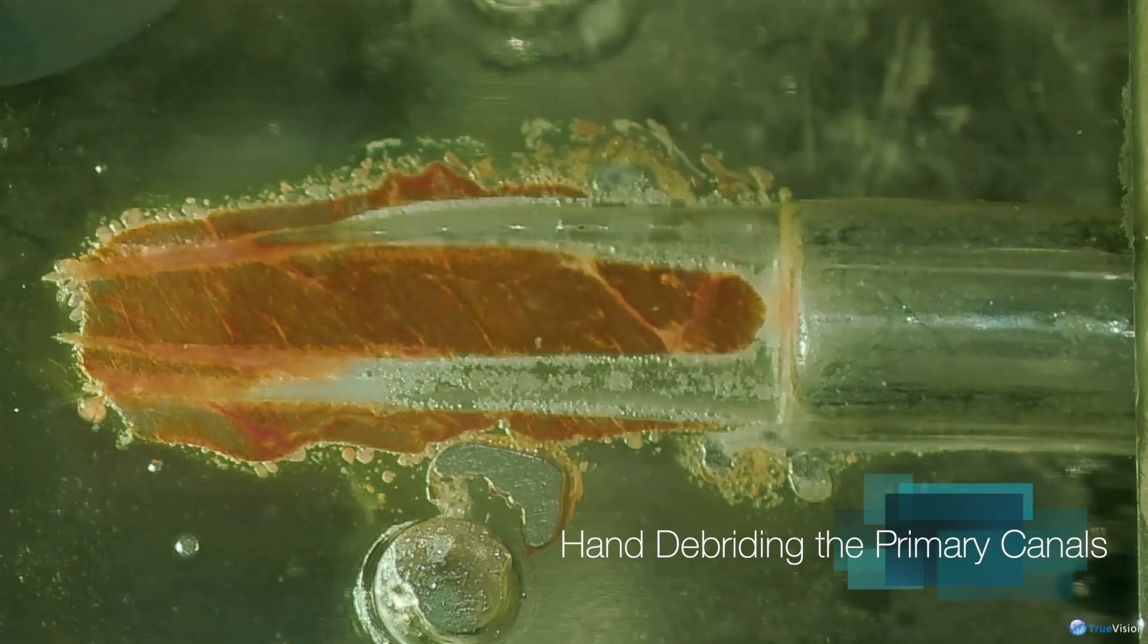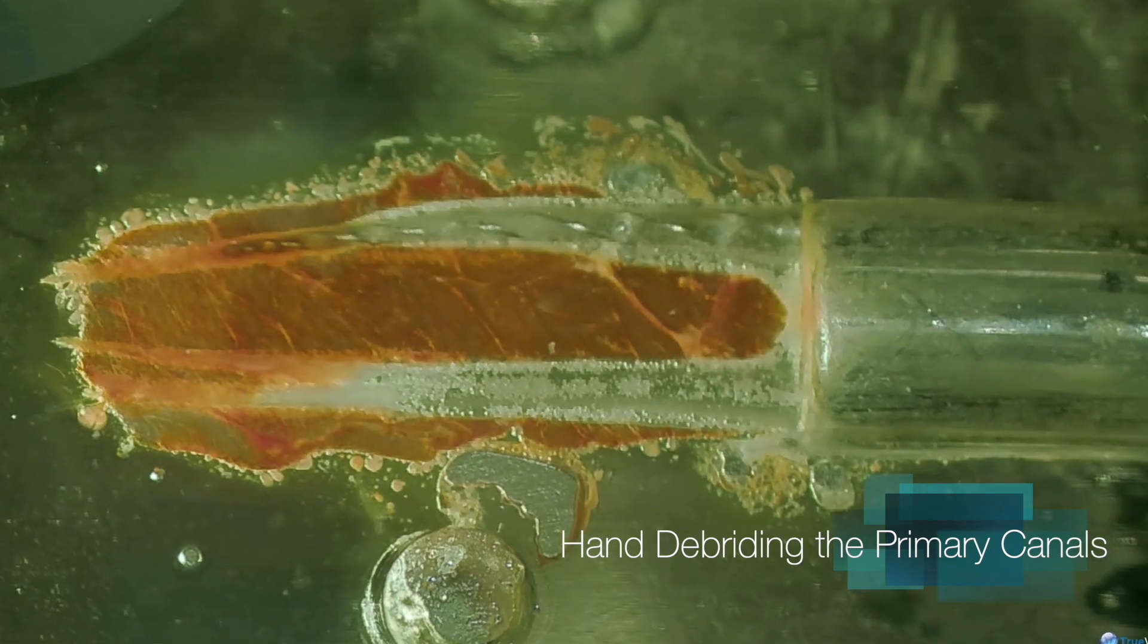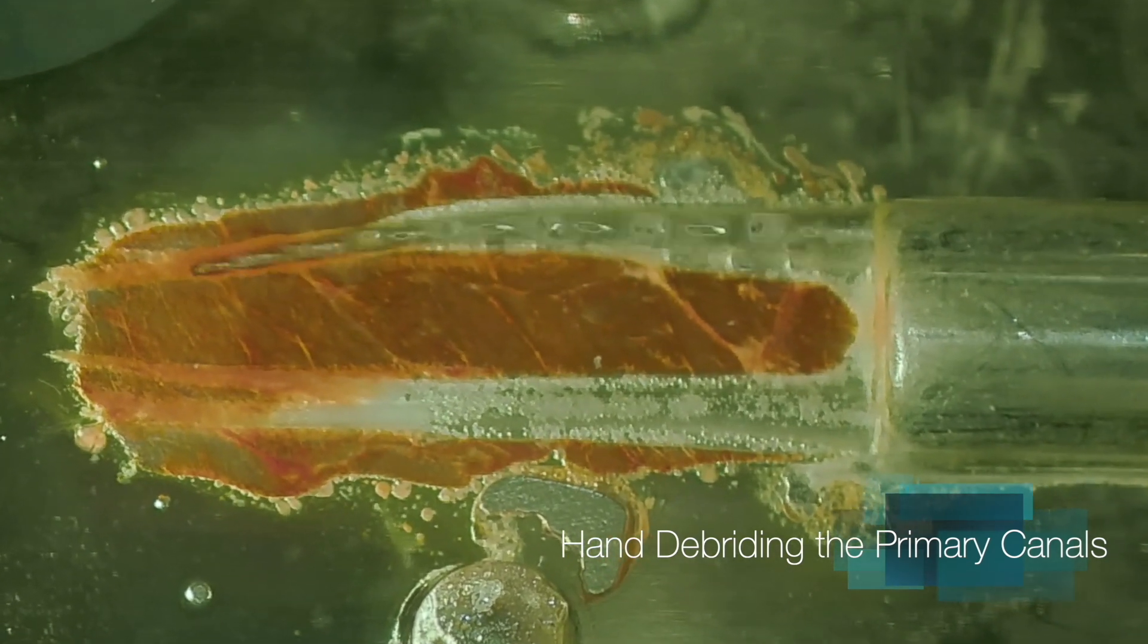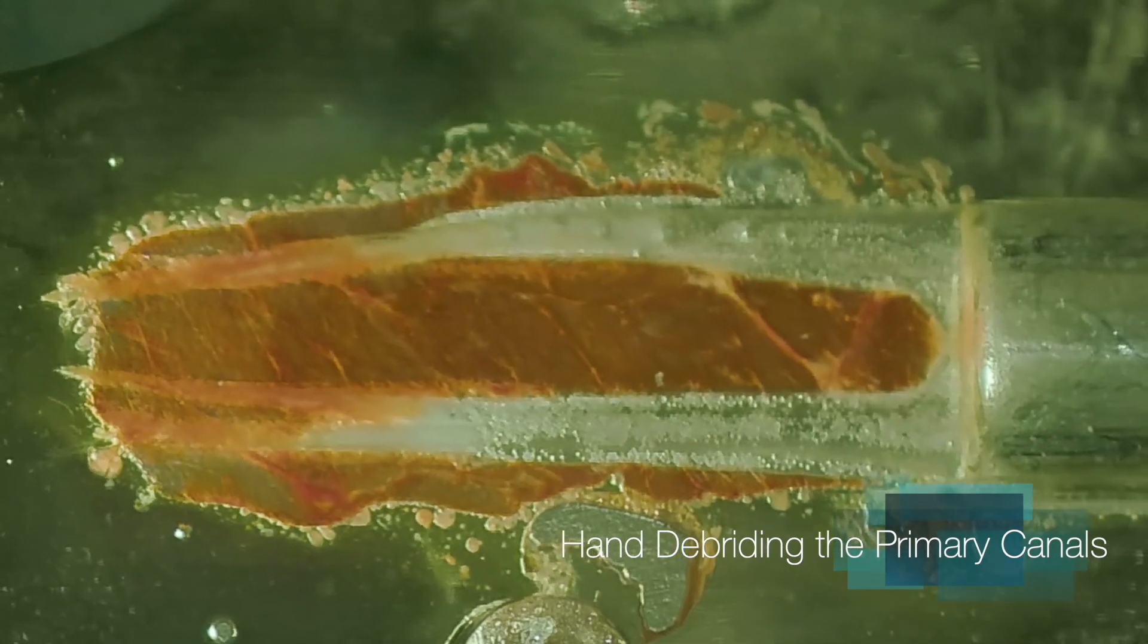Again, hand instruments debriding the primary canal. Using larger files, that was a 10. This is a rotary file used by hand. Still, all the debris pretty much left there.